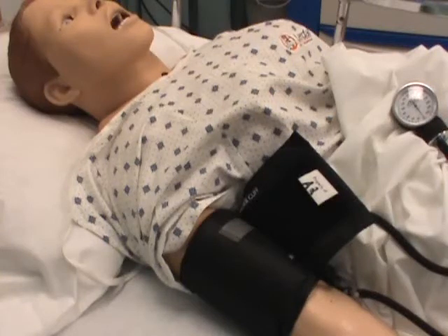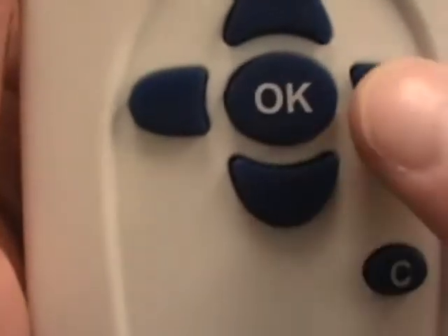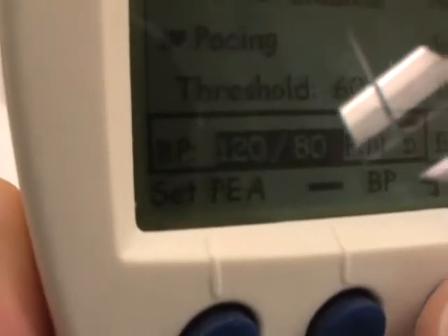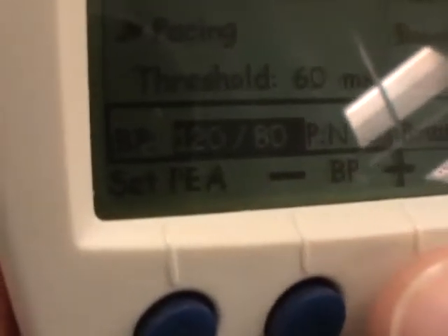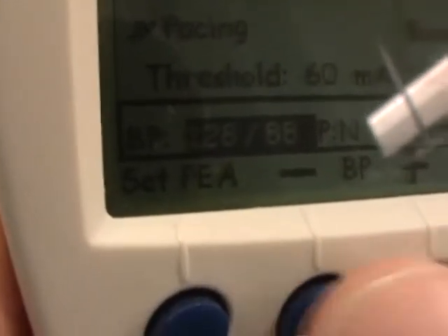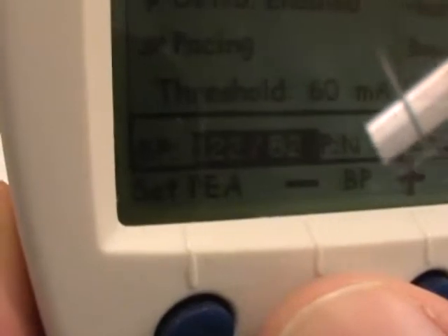So let's say we want to change the blood pressure now. Go to your handheld device. There's more than one way to change any of these settings, but we use the scroll keys in this example to scroll down to the blood pressure until it's highlighted. Then we can use the plus and minus keys that have BP in the middle of them — it increases and decreases in defaulted increments. If I press the plus key you can see it going up, and the minus key goes down.